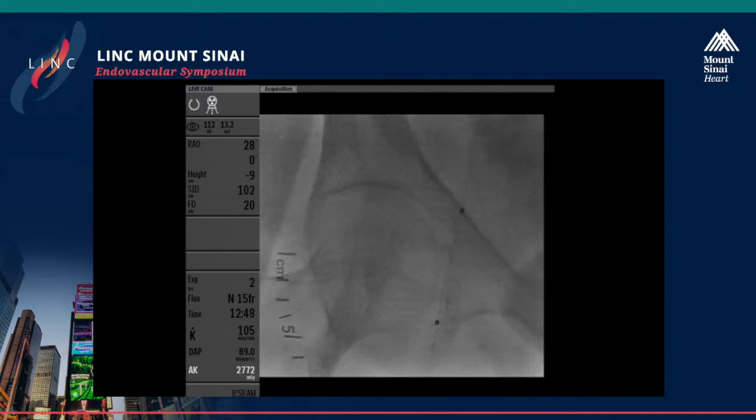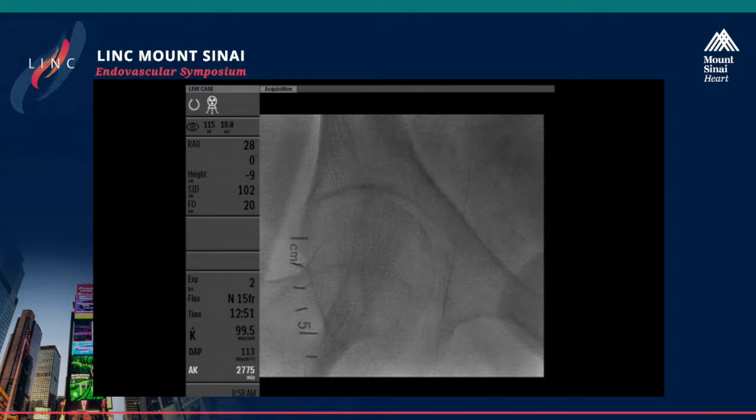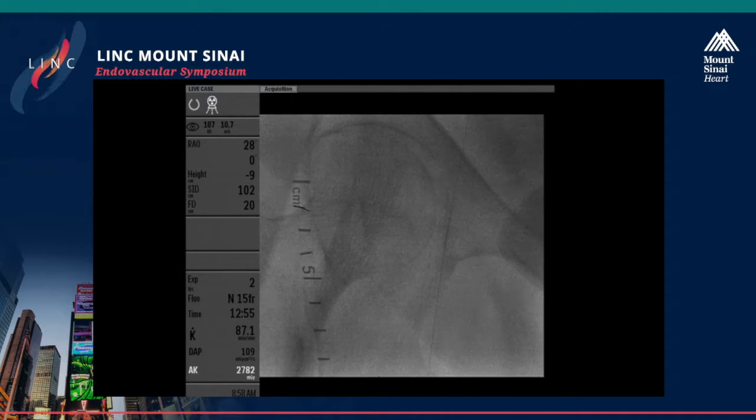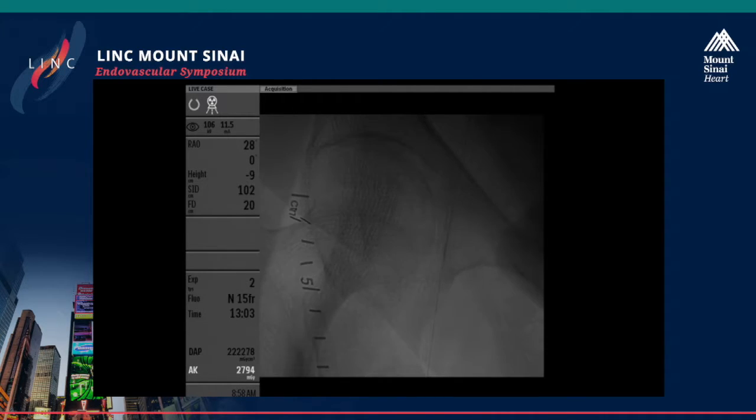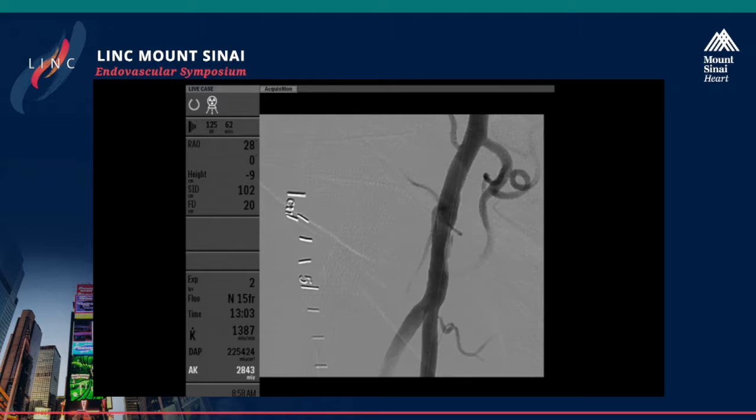And you can see here as we walk it out, I'm just going to hold the sheath and we'll take a picture and do a quick IVUS. So PK, one thing after you did the atherectomy, maybe you could have put a wire down the profunda just to protect that, as mentioned before. But we weren't going to actually touch the profunda with the balloon, so I don't believe we've crossed the ostium of the profunda with the balloon, although we'll find out now.